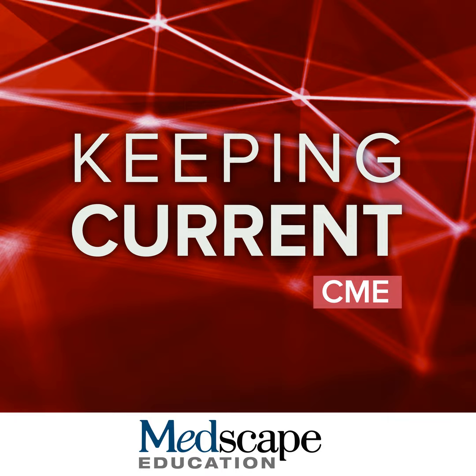Finally, there are some pitfalls which are operational. The exam is longer than usual because between the administration of contrast to hepatobiliary phase, we have to wait at least 20 minutes. They're also, depending on what we acquire before, up to 7 minutes additional. So we are looking at least about 30 minutes scanner time. Gadoxetate is higher cost than some of the other agents. However, there are multiple studies listed here that show that gadoxetate may be the most cost-effective strategy for multiple use cases, as you can see here.